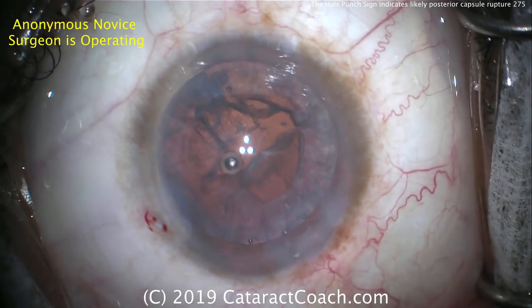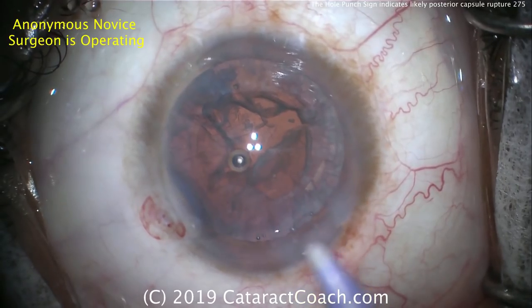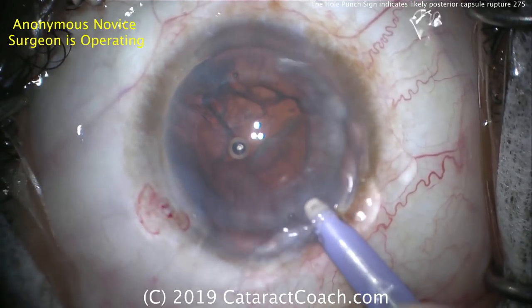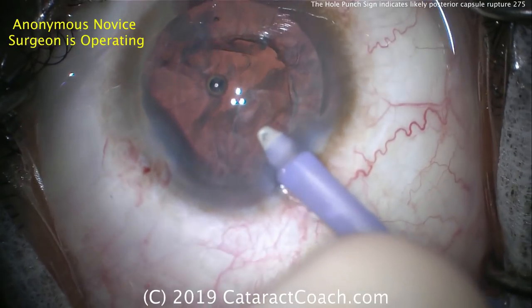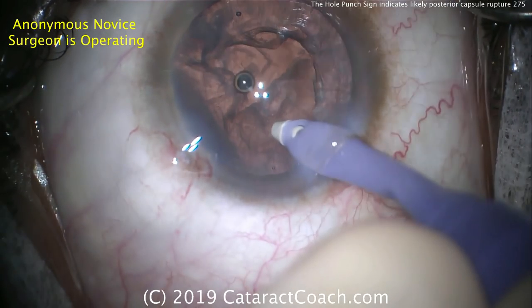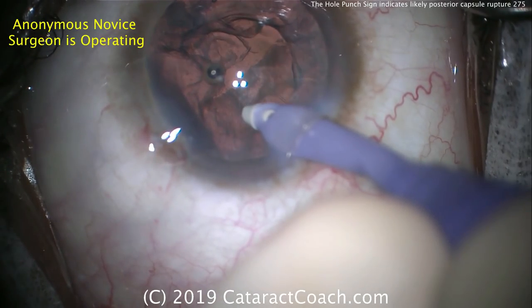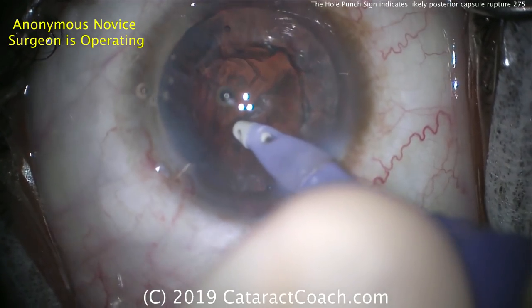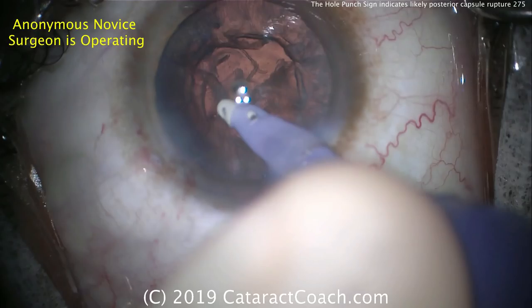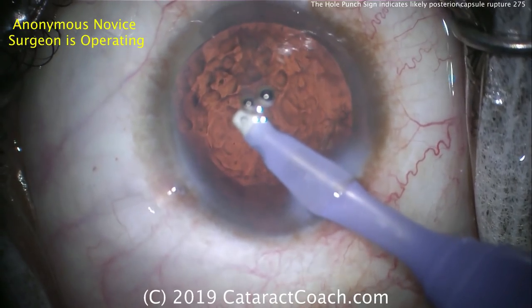Abandon the main incision, make two paracentesis incisions sufficient for the 23-gauge vitrectomy instruments and use them. In this case, the surgeon is going to use standard coaxial irrigation-aspiration — you can do this as well. You want to tamponade the hole in the posterior capsule and remove cortex in other areas prior to the cortex near the rupture. It would be really nice to use the bimanual anterior vitrectomy instruments — even on cortex mode on your machine, where it won't use the cutter and will just act as a bimanual IA.